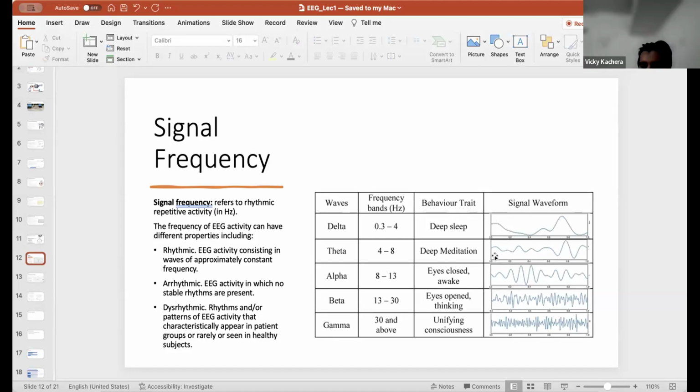So this is one sample actually. No, this is 250 samples. In 1 second, you have 250 samples. 250 or more, whatever. You can't make a peak in one sample, no? But if it is 250 samples, then how can we say that each one has the number of peaks in a second? Because this is very difficult.